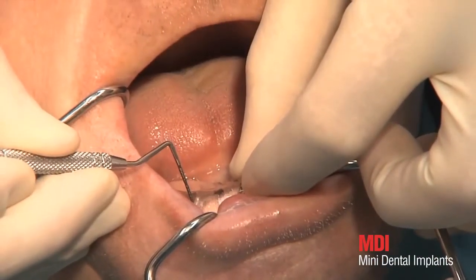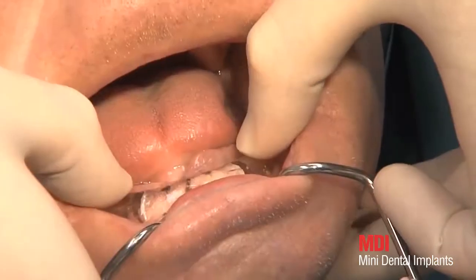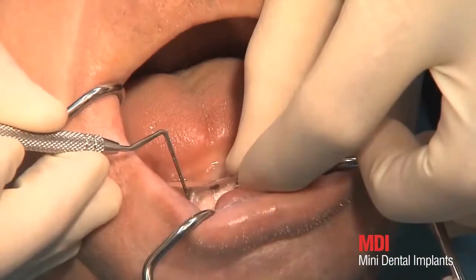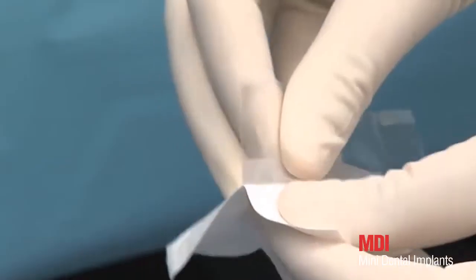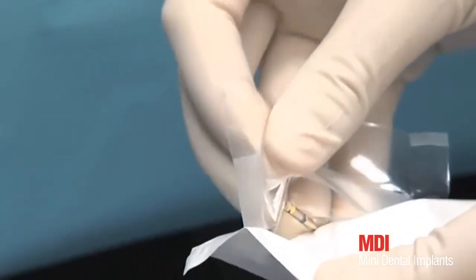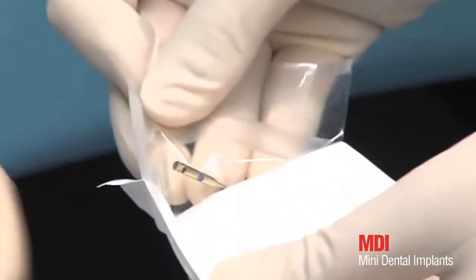The transfer of the distal implantation sites is done by using the template. With a probe, bleeding points are set on the mucosa. Pilot drilling is performed using a drill with a diameter of 1.1 mm.